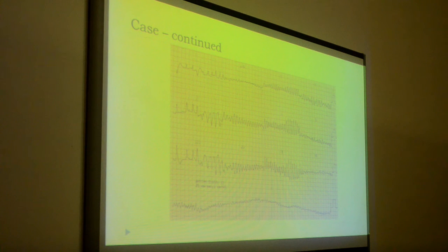Torsades de pointes? No, he didn't have long QT. If he had long QT and then developed this, okay, we'll call it Torsades de pointes. But this is Mr. X, the guy with the chest pain. And another thing, Torsades de pointes is a form of ventricular tachycardia, so they may not be.